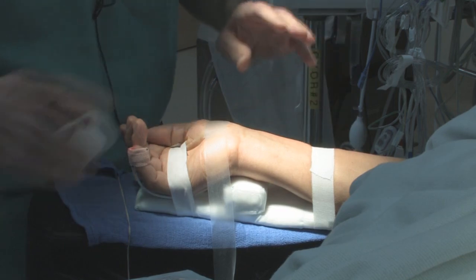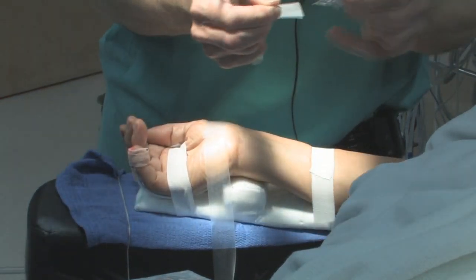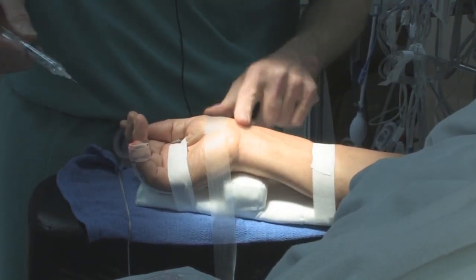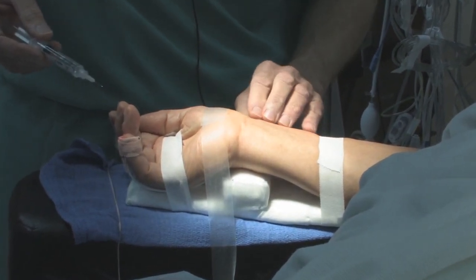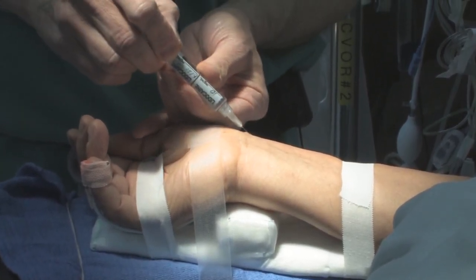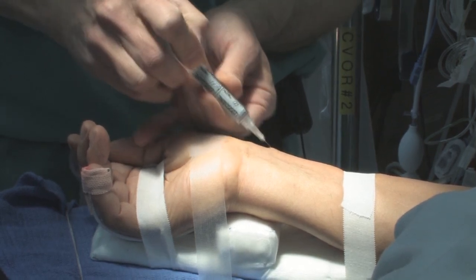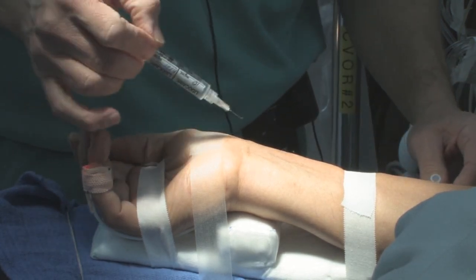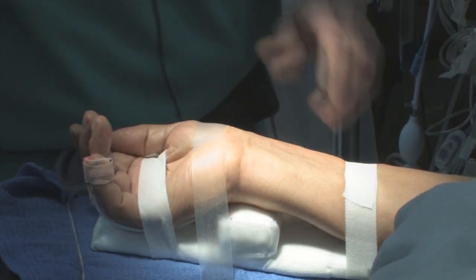I put the local in before I do it sterile. I try to go for a point about a finger breadth below the wrist crease — everybody has that crease. I feel where the pulse is, then pinch and go under with a small skin wheal. Just in case I get a hematoma, I follow it up proximally along a line so that if I can't hit it distally, maybe I can hit it a little more proximally.